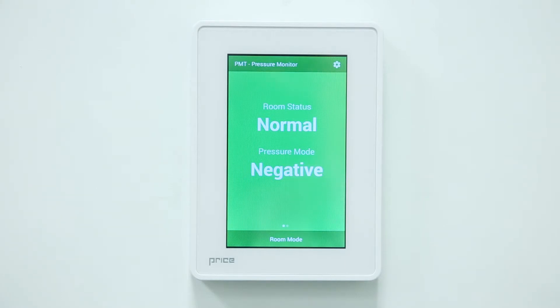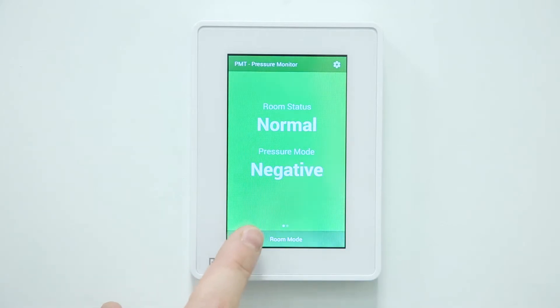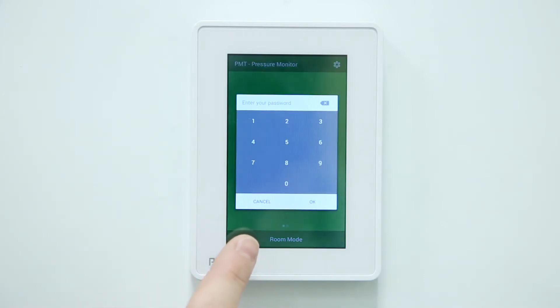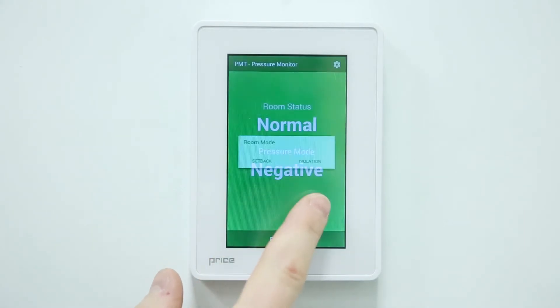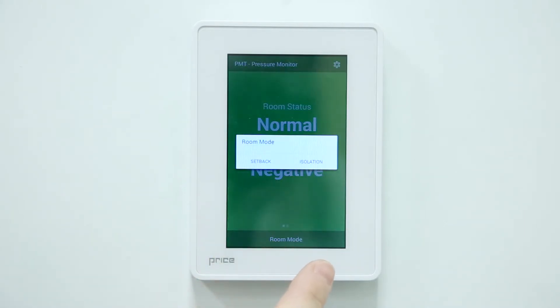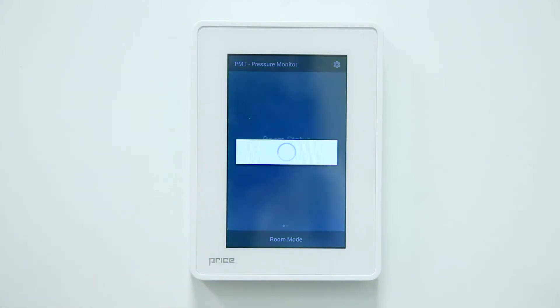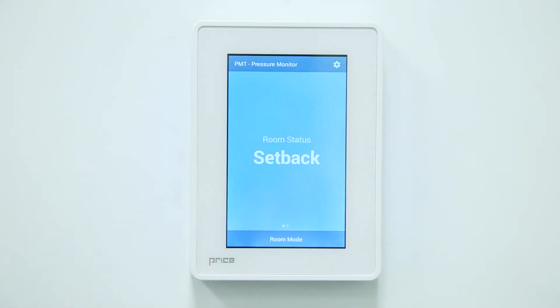To change the room mode to setback, touch the room mode bar along the bottom of the PMT. This will bring up a password protection popup. After entering the password, select OK and then select setback and the unit will go into setback mode. Both the screen text and color have changed to indicate setback mode.